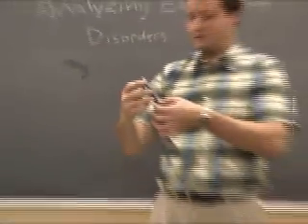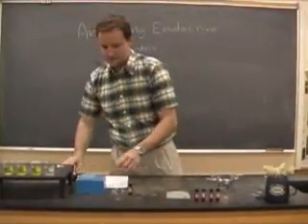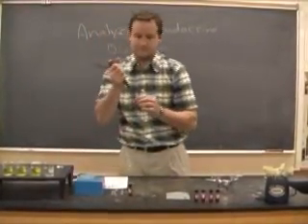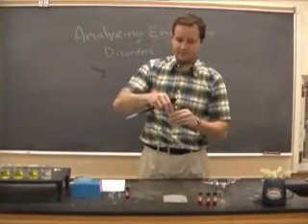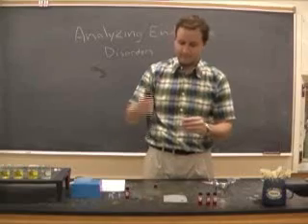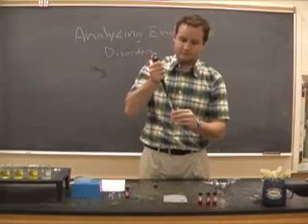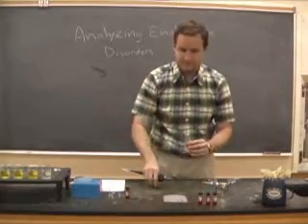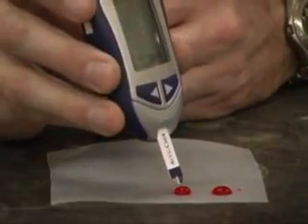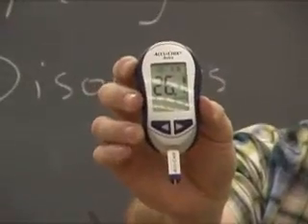All right, let's take a look at sample B. Put it right beside sample A. And wait till it tells me it's ready to test. And let's try. Okay, there's the result.